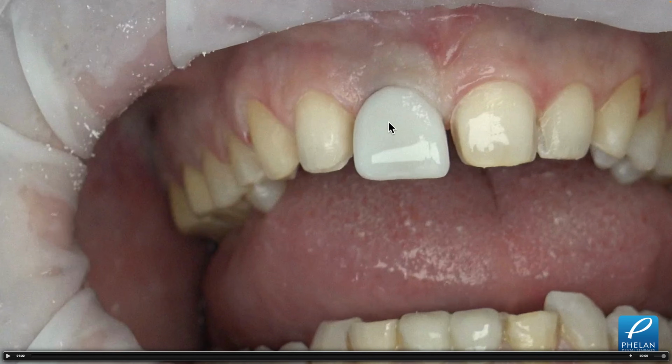And here, if I have an implant and I have a veneer on either side of the implant, you'll notice I didn't break contact between my veneer preps, at least most of the places. But I did break contact here and here because there is a broken contact because the tooth is missing. So when we have that situation, I'm generally driving my finish line to the palatal incisal. So the palatal incisal and the mesial palatal in this case, and the mesial palatal here.